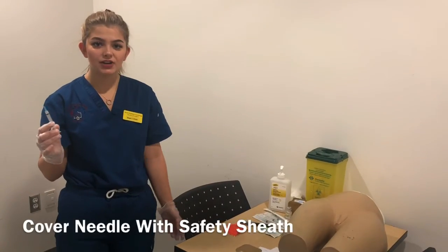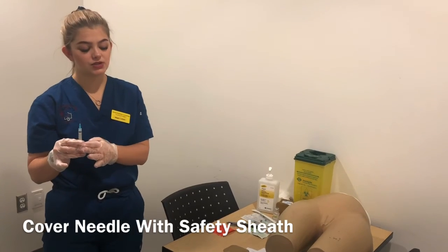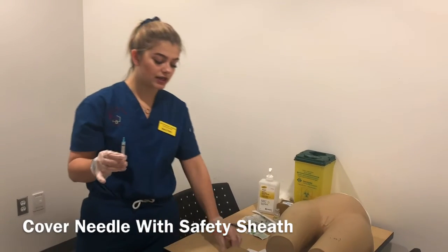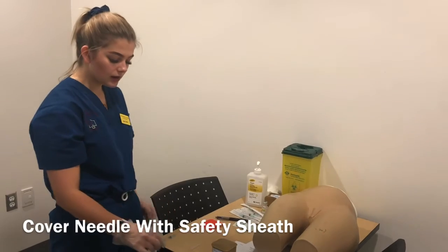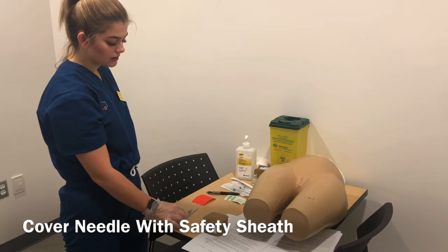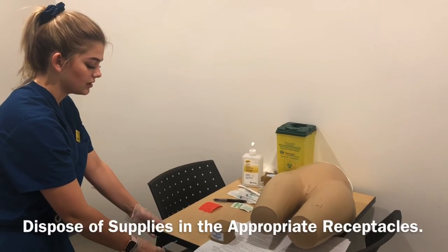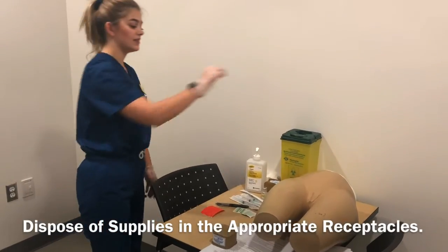Okay, so again, after administering medication to Mr. Mancini, you just want to ensure that there's no needle stick injuries when you're disposing of it. So again, you're just going to recap your needle on a flat surface. And then on a steady surface, we're going to push the needle back in and dispose of it in the sharps container.